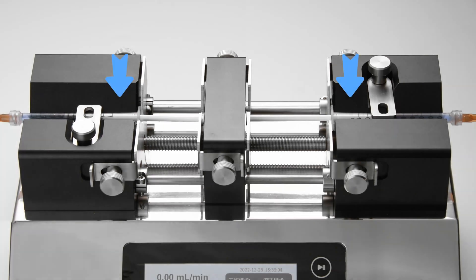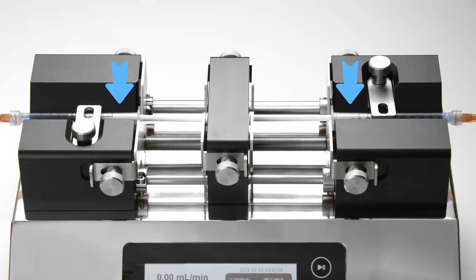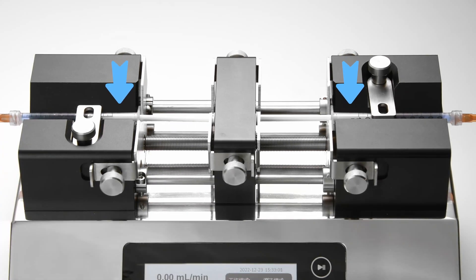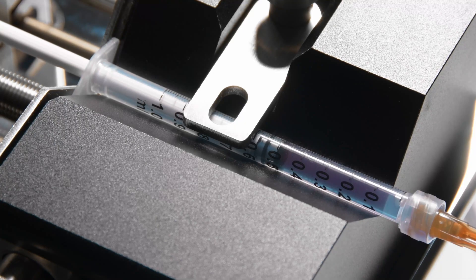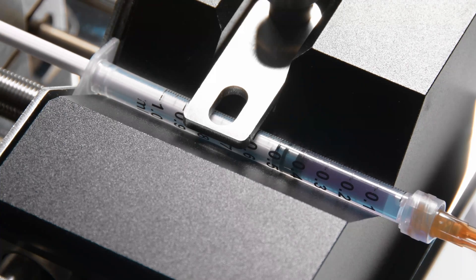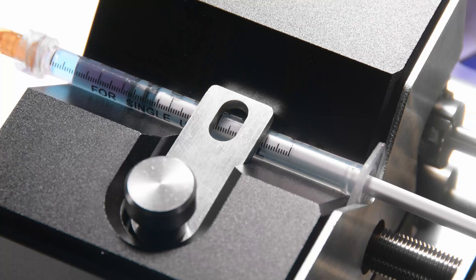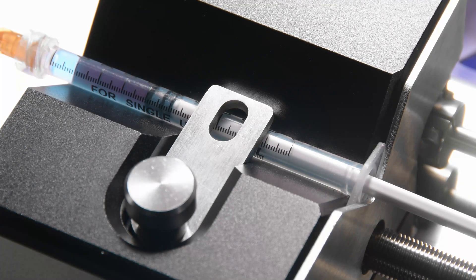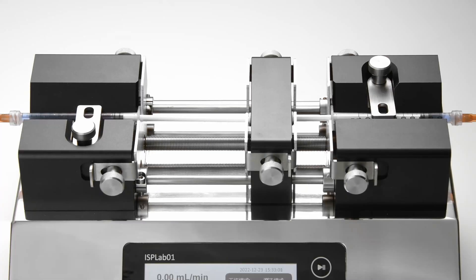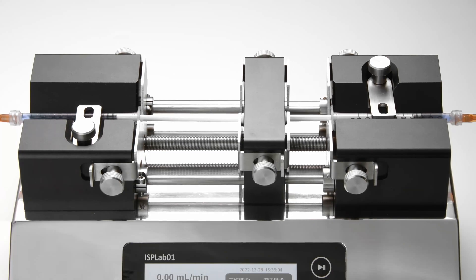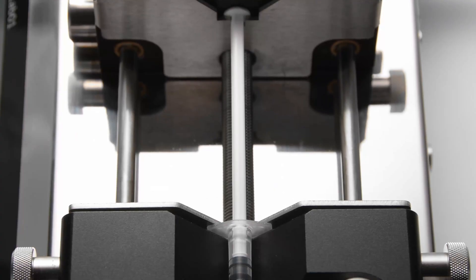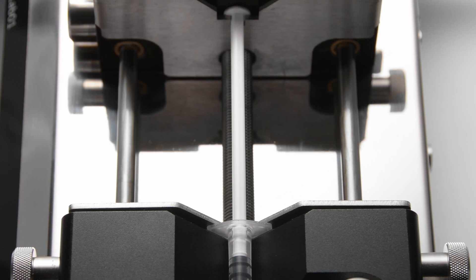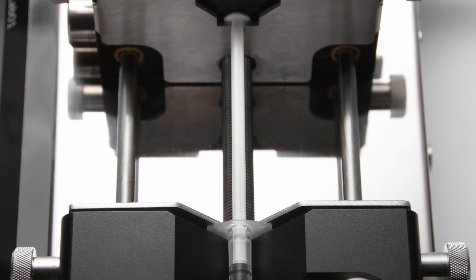Even if some syringe pumps can install two syringes back-to-back, one infuses while the other withdraws, alternately reciprocating. But there is still a breakpoint at the moment of switching directions. The technical problem we want to overcome is how to infuse continuously and uninterruptedly.